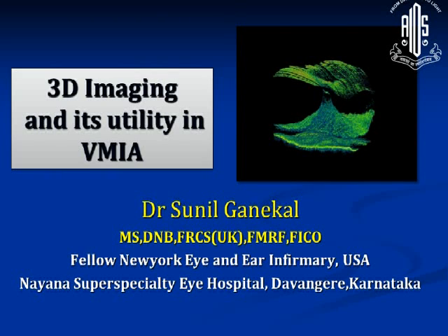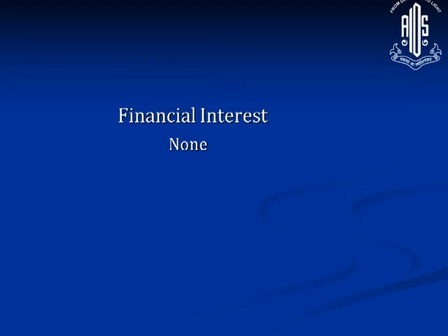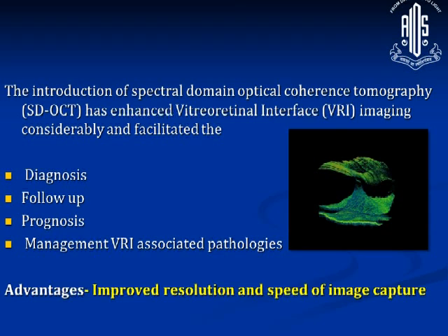With the advent of OCT, definitely the one retinal disorder which we have started to detect more and treat more, prognostically as well as for better treatment, is the vitreomacular interface. Let me go through some other things. I don't have any financial interest regarding this presentation.